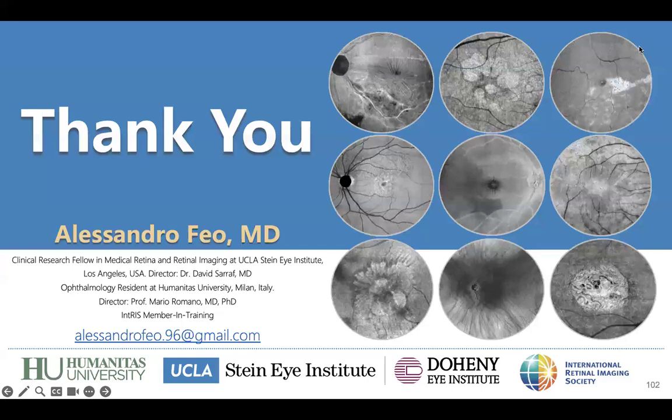Okay, Alessandro, I'm passionate about ultra-widefield OCT. I use it in my daily practice. I use the Forum software, and I can cross all the multimodal imaging.